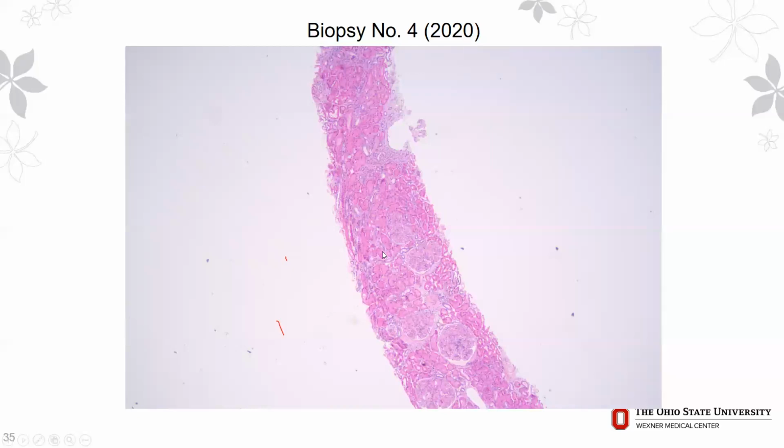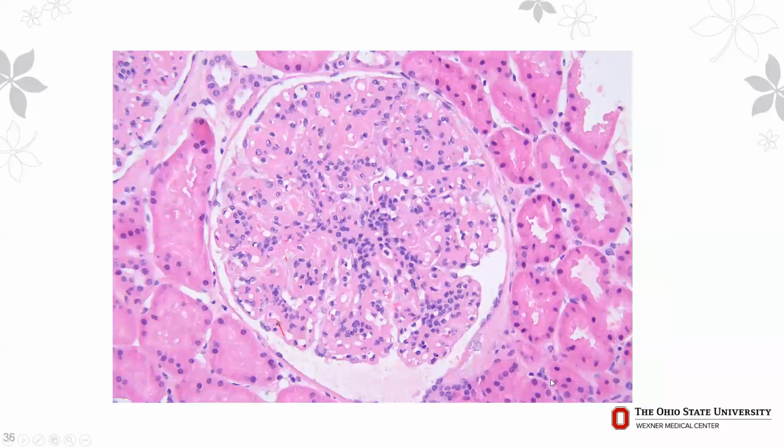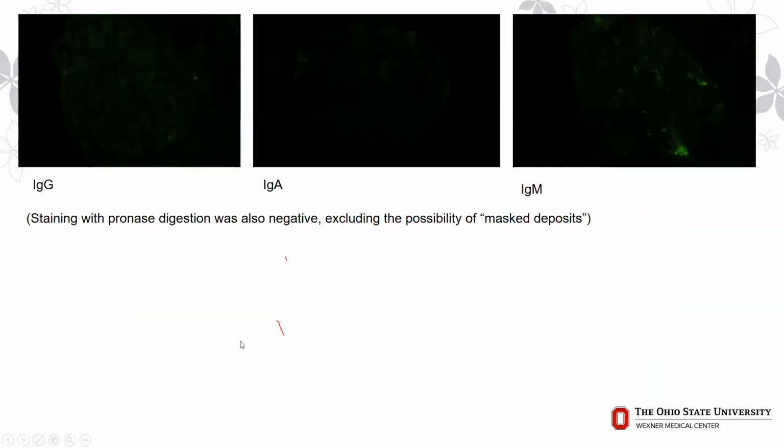Again, same thing, glomerular changes were still present, unchanged. Big glomeruli, MPGN pattern, a lot of hypercellularity. Fortunately, no crescents or anything. But on immunofluorescence, to our surprise, the IgG had gone, it had disappeared. IgA and IgM were always weak, but IgG was no longer there.